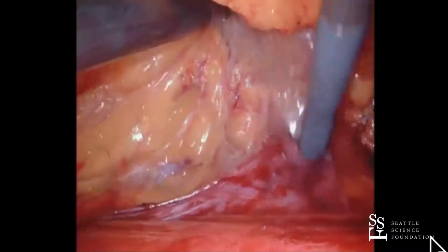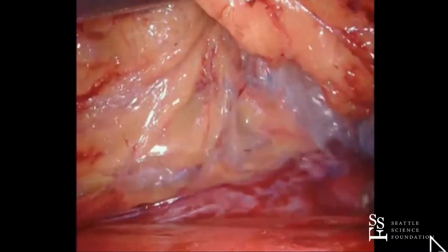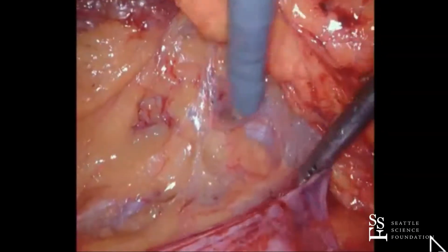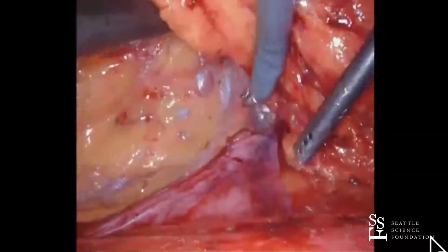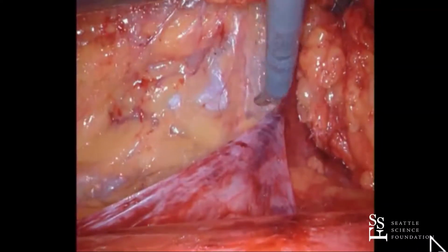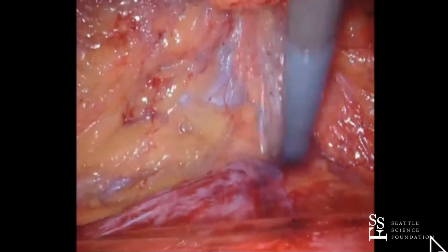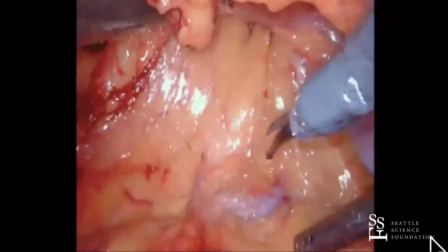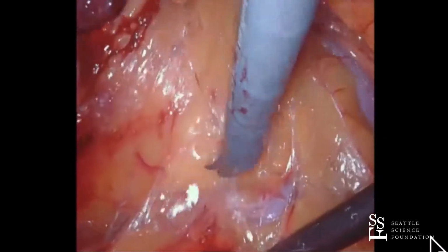Also, if you really want to find things and be a complete surgeon, you can find the ureter. It's going to be right in here, and I'll show it to you. This is kidney you're seeing right there. And you can see how quickly, once you're in, this operation is, you know, you're on things.